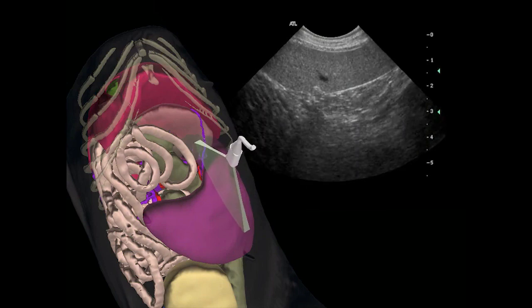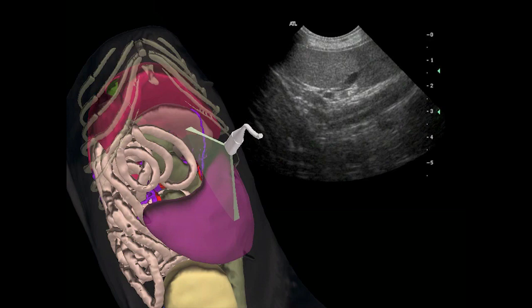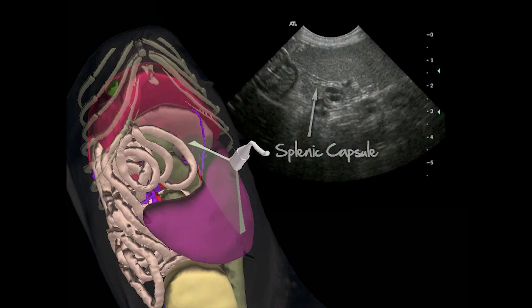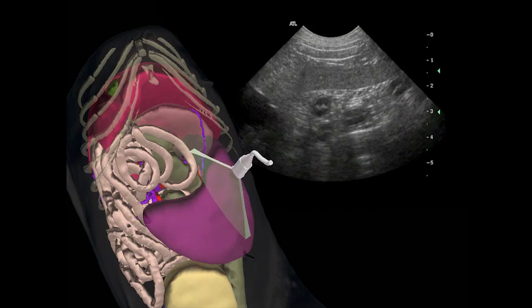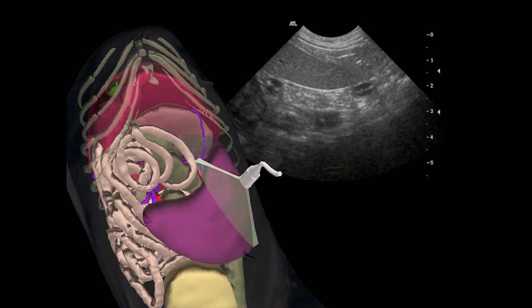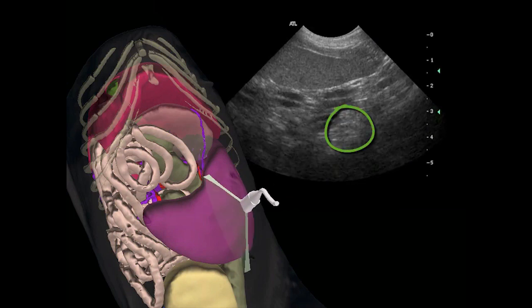The spleen is one of the most echogenic organs in the abdomen. Its parenchyma presents a fine echotexture, and its veins are anechoic and easily visible as they cross the hyperechoic capsule. Dorsally, you can see a few intestinal loops caudal to the stomach. These intestinal segments are loosely distributed in the mesenteric and omental fat that shows scattered hyperechoic lines.